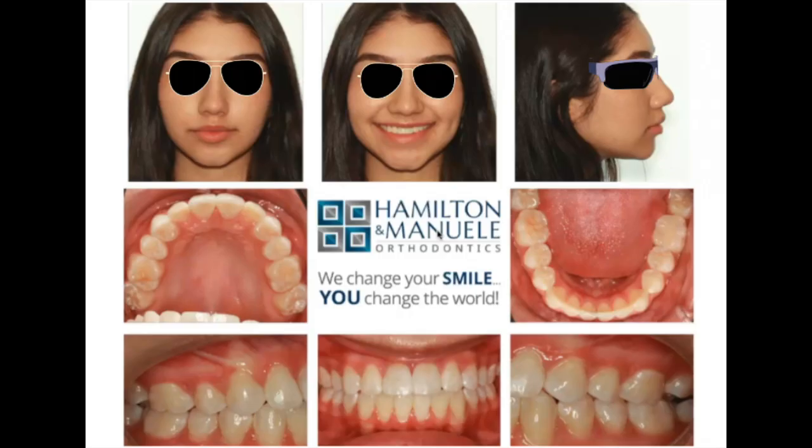And then she went to the restorative dentist, and the restorative dentist was able to rebond the centrals so that it's matching, and to bond the canines as well. Now, again, hindsight being 20/20, our mechanics anchored to the posterior teeth for the anterior extrusion did help our occlusal plane, but in the end we ended up a little bit vertical maxillary insufficient.